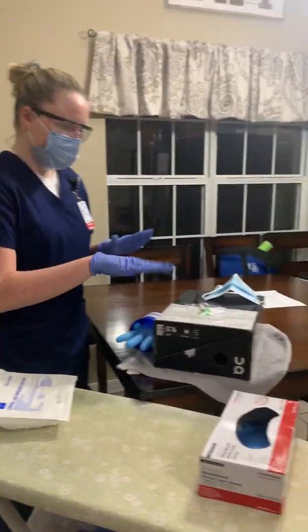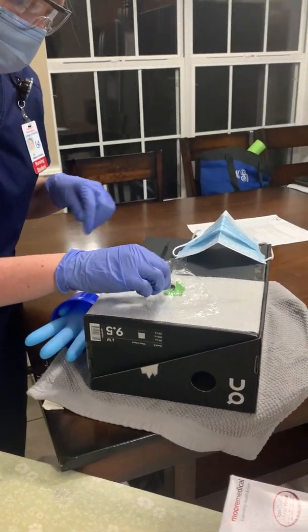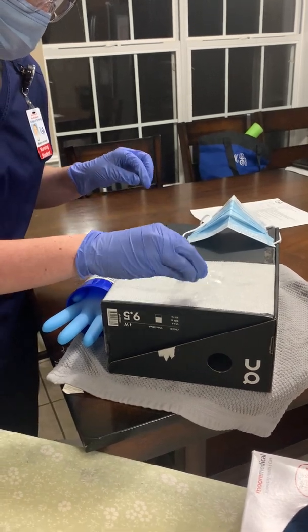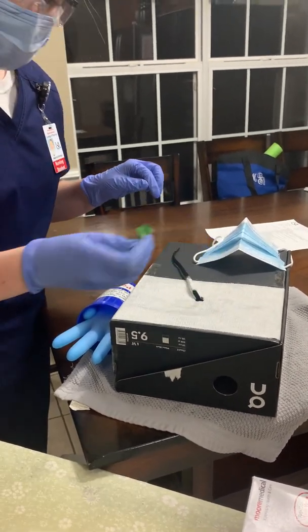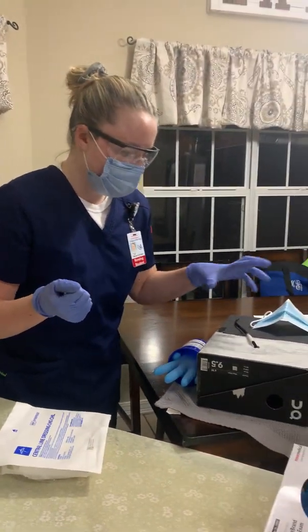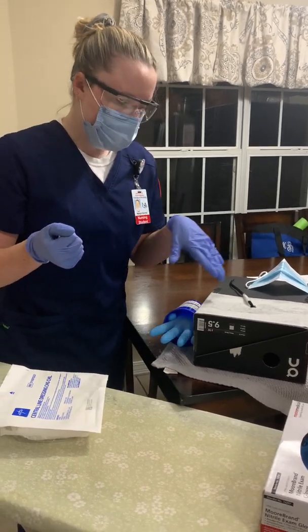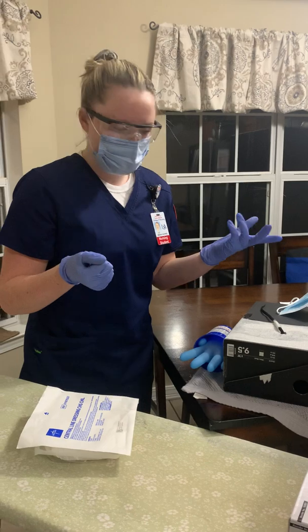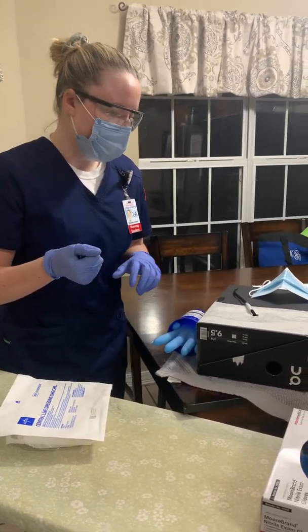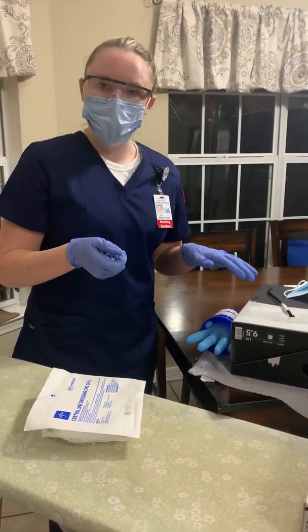Okay, I'm going to go ahead and take off the dressing. So I'm going to peel up at the edges, making sure not to touch the hub. I'm going to peel towards the center, and also take off the bio patch. And once I'm doing that, I'm going to assess the skin and the skin integrity, as well as the port that the central line is in, or the incision the central line is in. Looking for any drainage, any swelling, or any signs of infection. And if a culture was needed, it could be obtained at this moment.